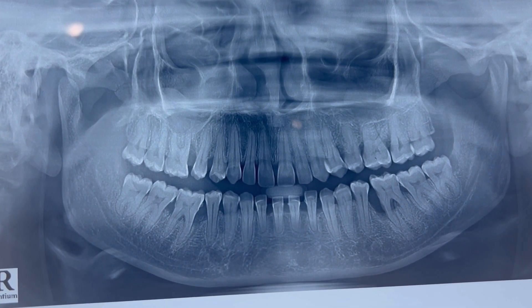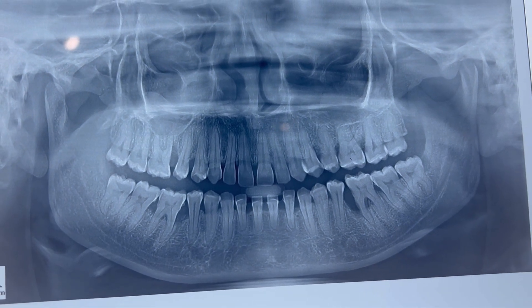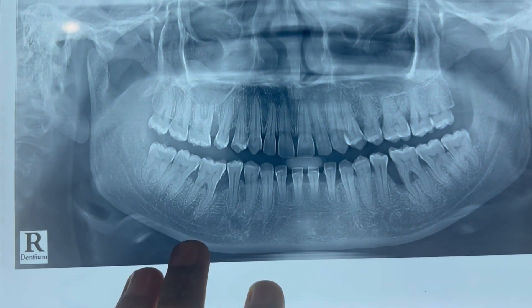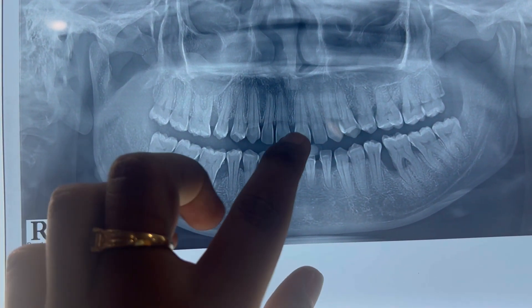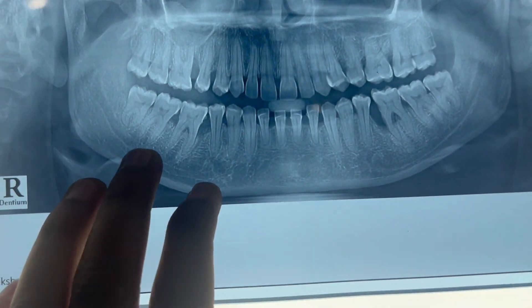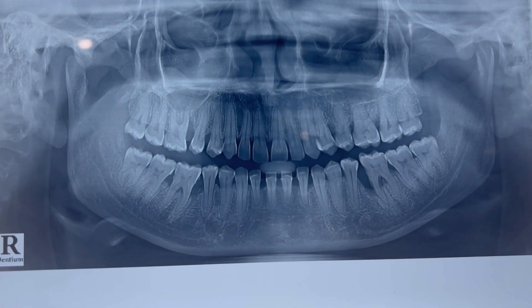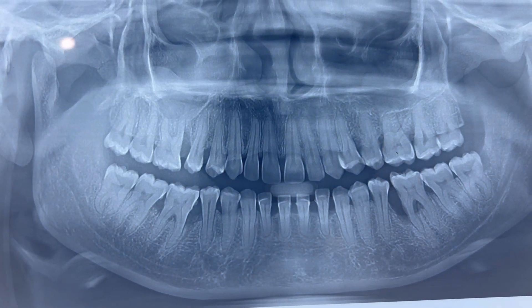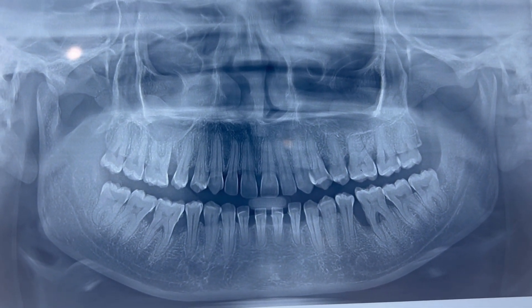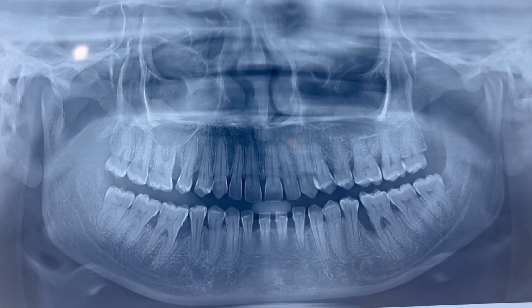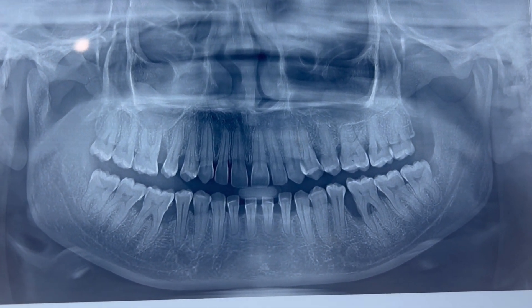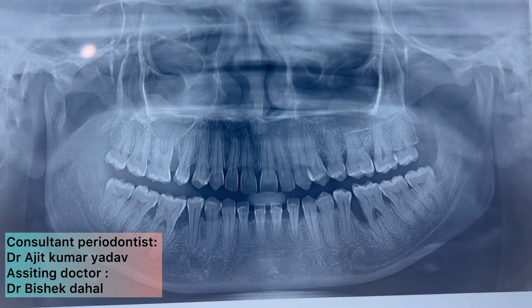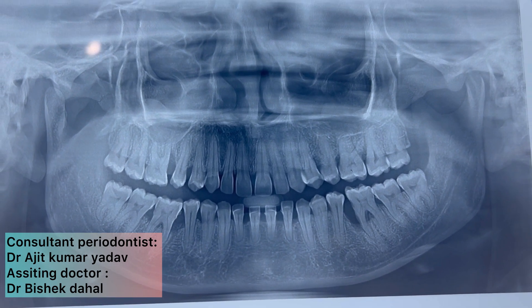We planned for open flap debridement — flap surgery with GTR membrane. We are planning to do flap surgery today in the first quadrant and also place a GTR membrane. We will show you all the process and steps of open flap debridement with placement of GTR membrane. Our main surgeon will be Dr. Ajit Kumar Yadav, and I will be assisting him.